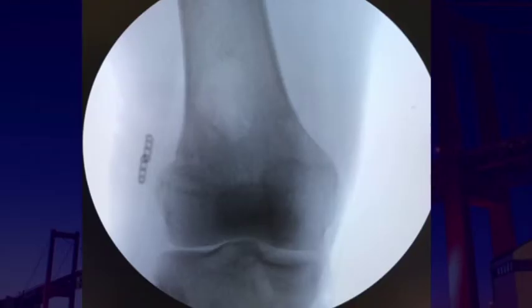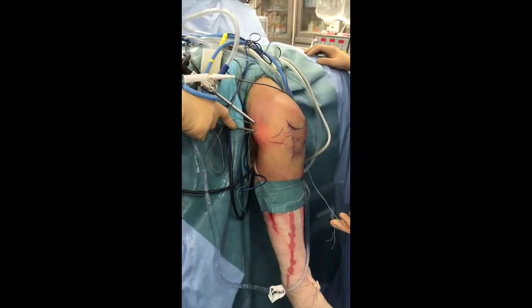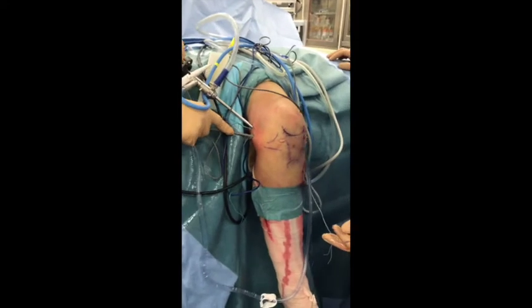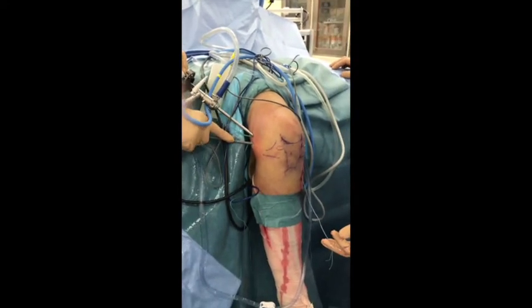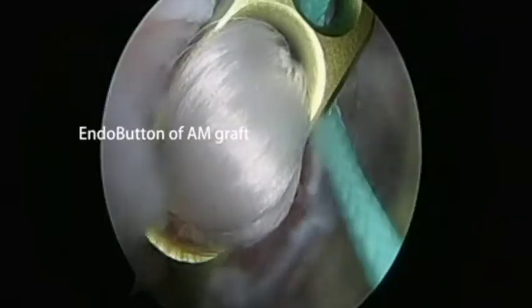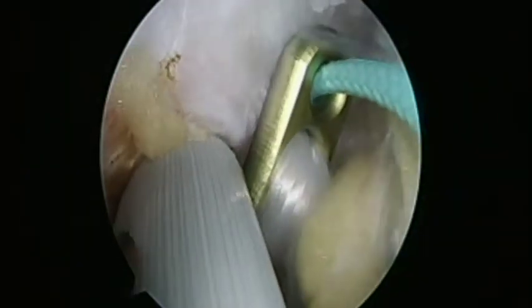After passage of the ACL graft and flipping the endobutton, fluoroscopy confirms the position of the endobutton. In cases where the endobutton has migrated from the lateral aspect of the femoral cortex, a 30-degree scope is introduced into the lateral femoral portal to identify the malposition of the endobutton in relation to the lateral aspect of the femoral cortex.